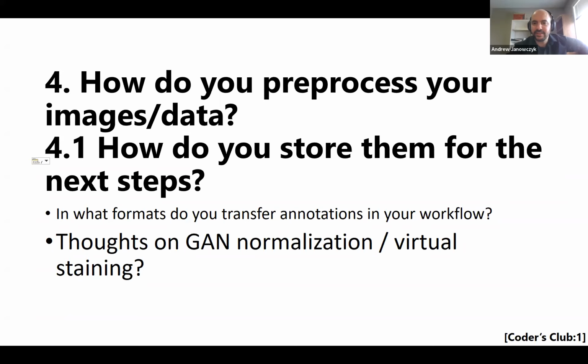So I have two thoughts that I'd like to put out there and see what others think. First, I find that training GANs to do this can be tricky, and you end up training multiple models, and oftentimes you'll have crazy artifacts. You'll be like, oh, this was a bad model, this was a bad model. Oh, this one converged to something that's reasonable, and then you use that process of elimination. So I find that frustrating. I don't know if someone has a better approach or code that consistently converges to something that's fantastic and artifact free, but I would be very open to using that going forward.